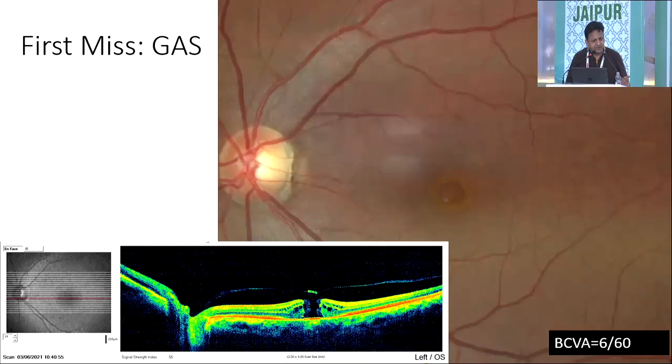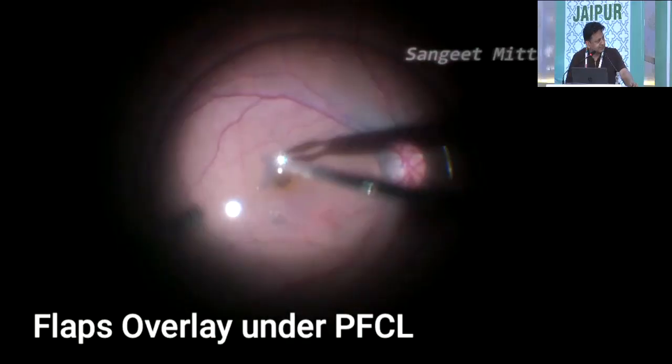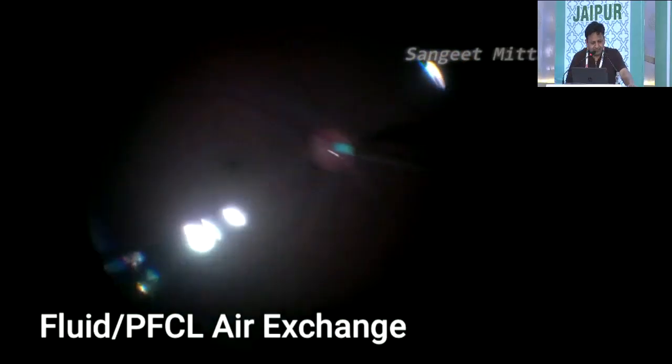And this was the first miss. I missed my gas. Suddenly my assistant told me when I was operating that the gas had finished and I have run out of gas and now what to do. So the PFCL was used to stabilize the ILM flap, which was then inverted beneath the bubble. Fluid was exchanged with air and closure was done without gas.